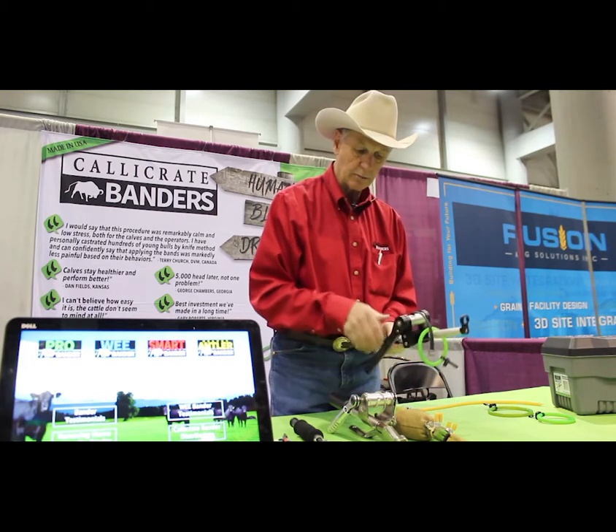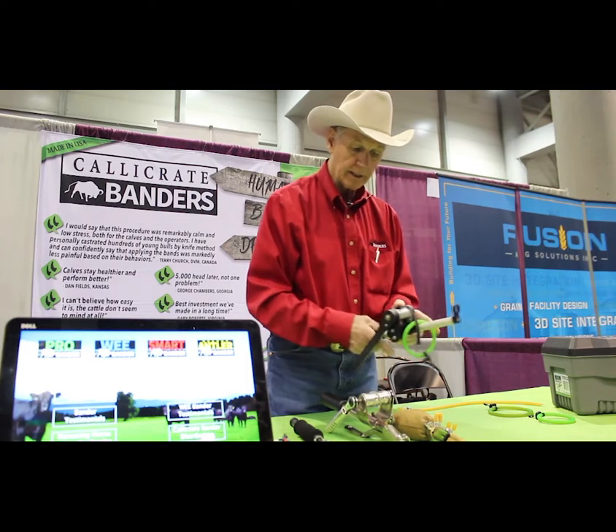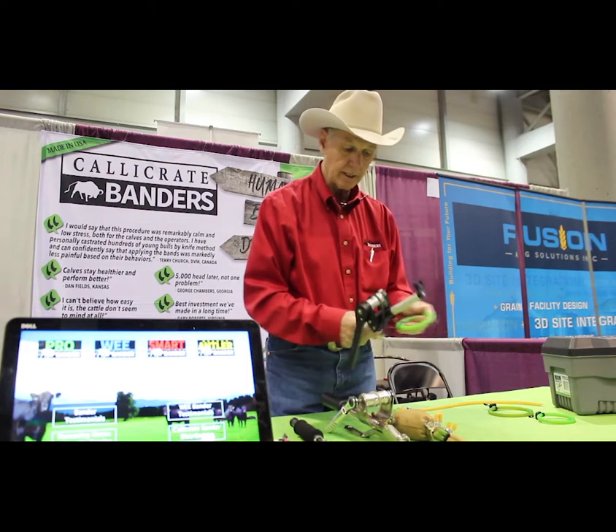They came up with the Pro Bander, and it's another version of the Smart Bander. It's another Bander for doing larger animals.